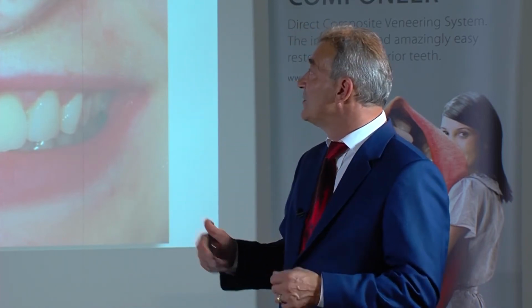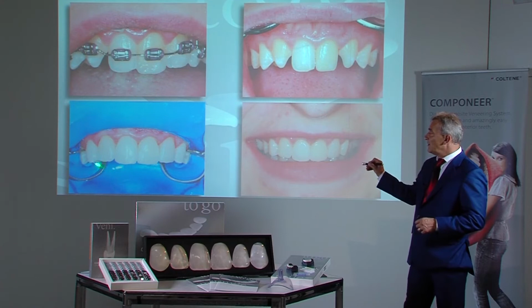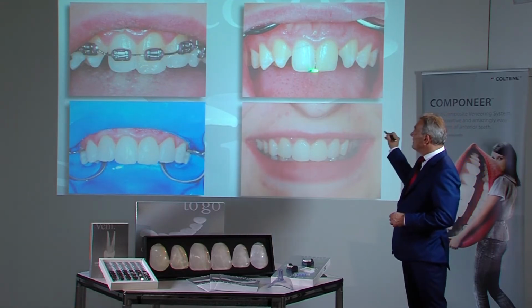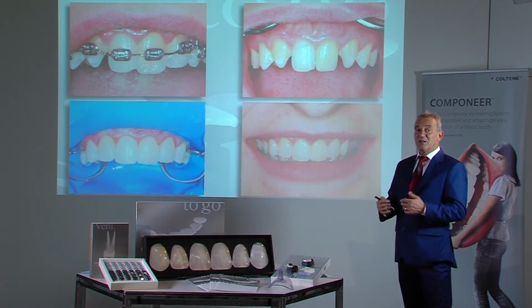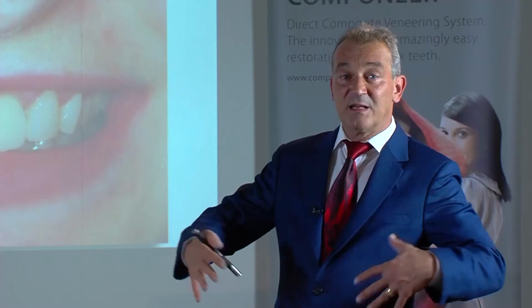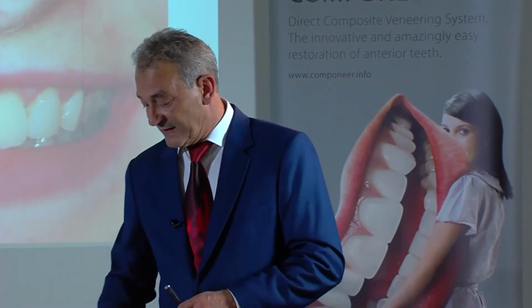The Componeer white opalescent was placed together with dentine material. As the canines are in palatal direction, they do not need to be prepared. Had they been very bulbous, they would have required additional preparation.